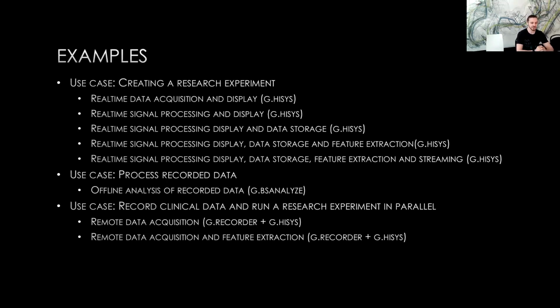This would be different research use cases where you could separate backend and frontend, and stream data from one application to another. Later, I'm going to show you how to process the recorded data in GBS Analyze. And finally, I'd like to show you the G-Recorder, which is usually used in clinical environments, and how you could do some data acquisition within a clinical environment and run a research experiment in parallel. Therefore, I'd like to introduce my colleague, Michael Jordan, who is going to be my subject today.